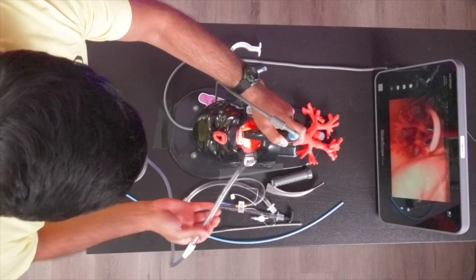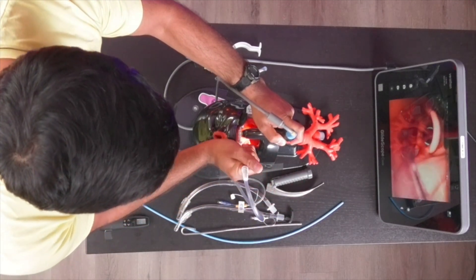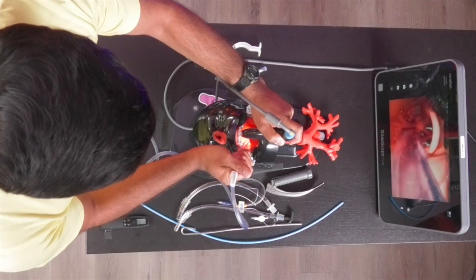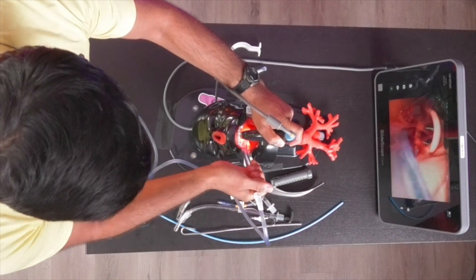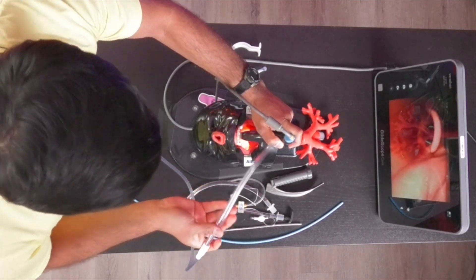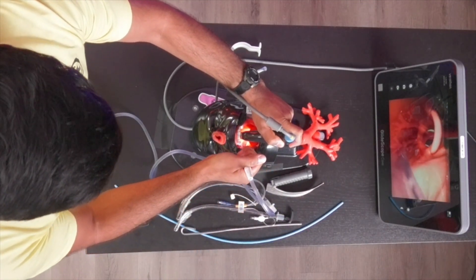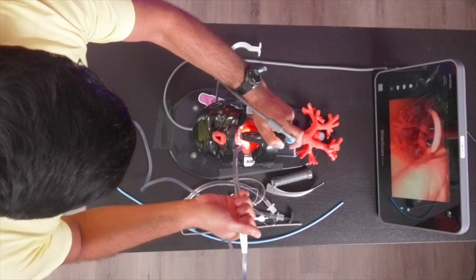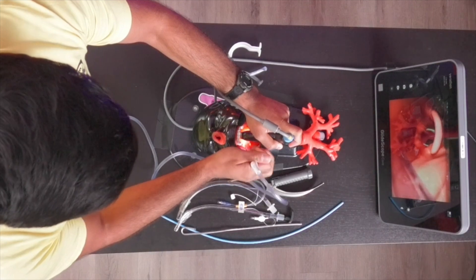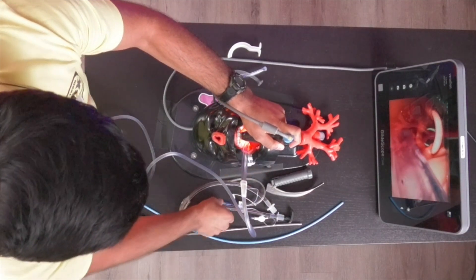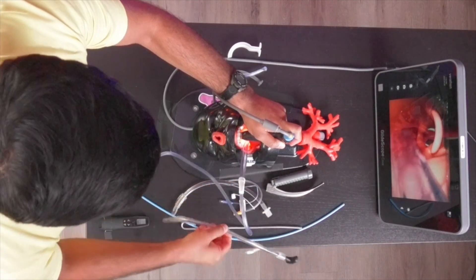Using my suction, I can suction the posterior oropharynx, get into the esophagus if I need to, as well as get into the trachea and suction all of this area. In this situation, it may be necessary to keep the suction in the mouth and hypopharynx. The problem with doing that on the right side of the laryngoscope is that you now don't have the space to bring in your ET tube.